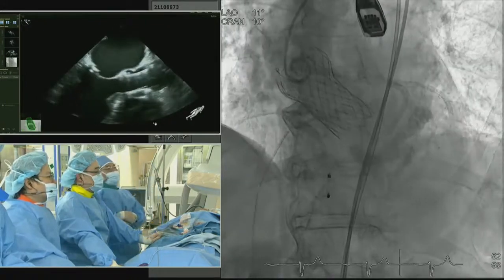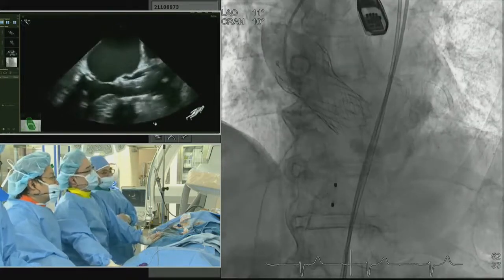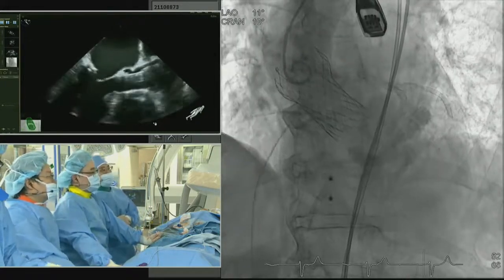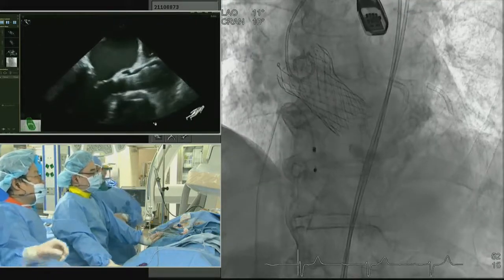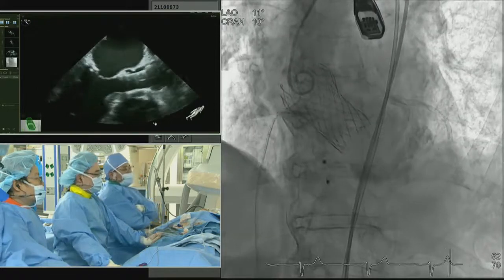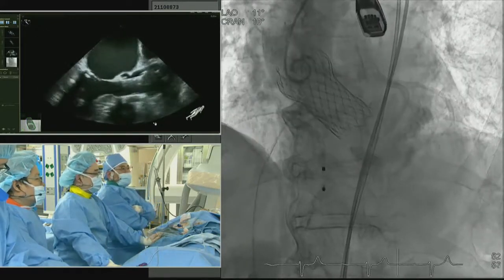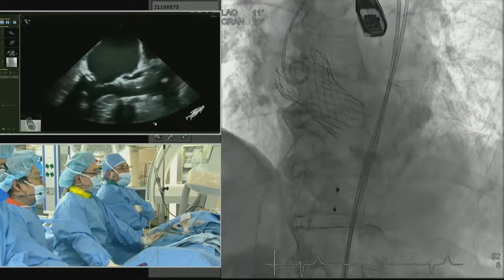You really stayed with it and recaptured twice. And I think on the third attempt, you implanted very shallow. We congratulate you, and I think that the last question will be the policy on leaving the pacemaker because the patient has third-degree block.